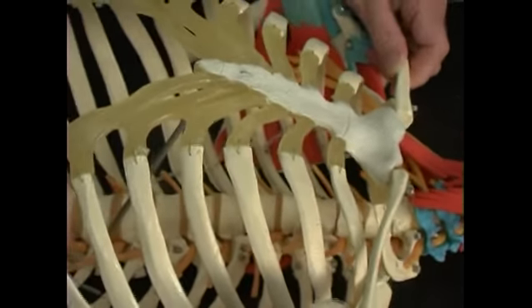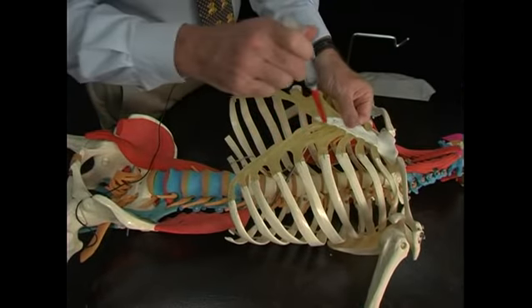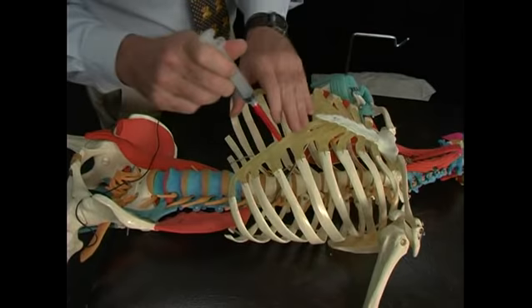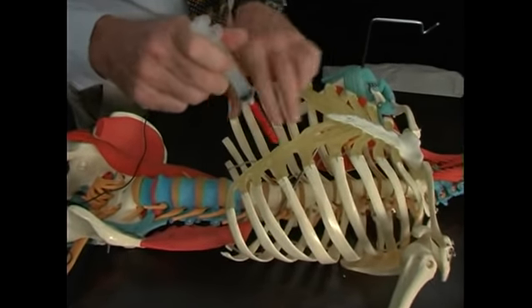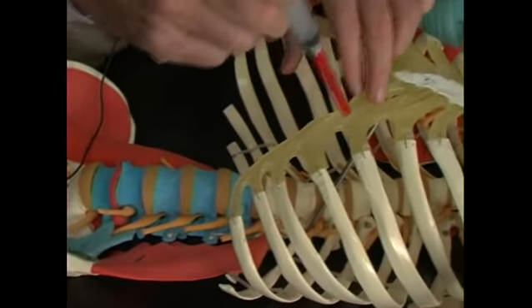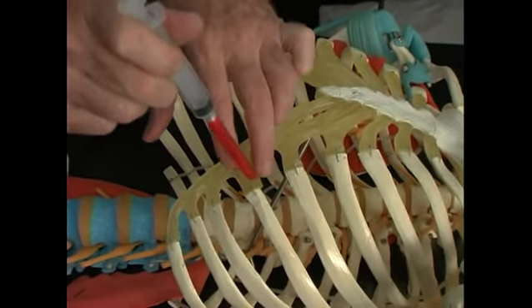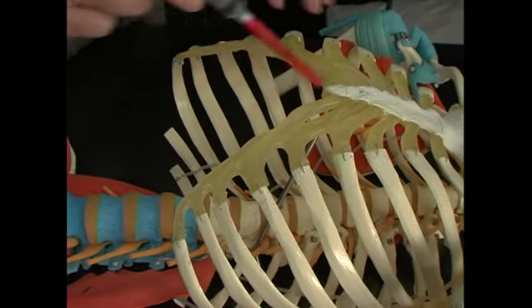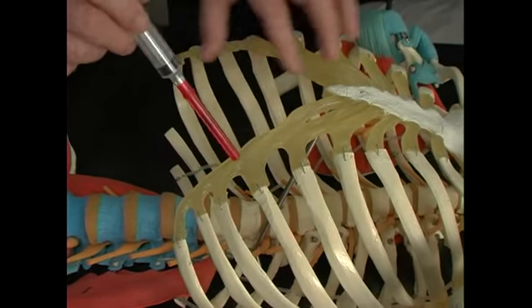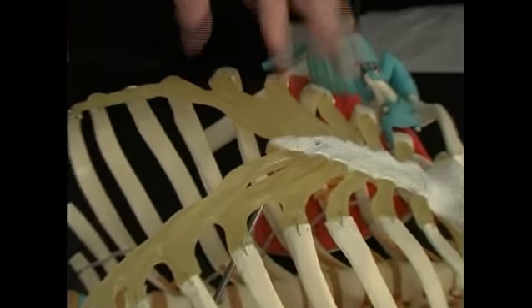When we get down into the lower rib cage, as we mentioned, the chondral area gets larger, with a rubbery feel to it, and we need to carefully do that and pepper that entire area everywhere it's tender. And I found that a real meticulous peppering of that does a much better job of that. We can also do the xiphoid if we wish, if that's tender as well.